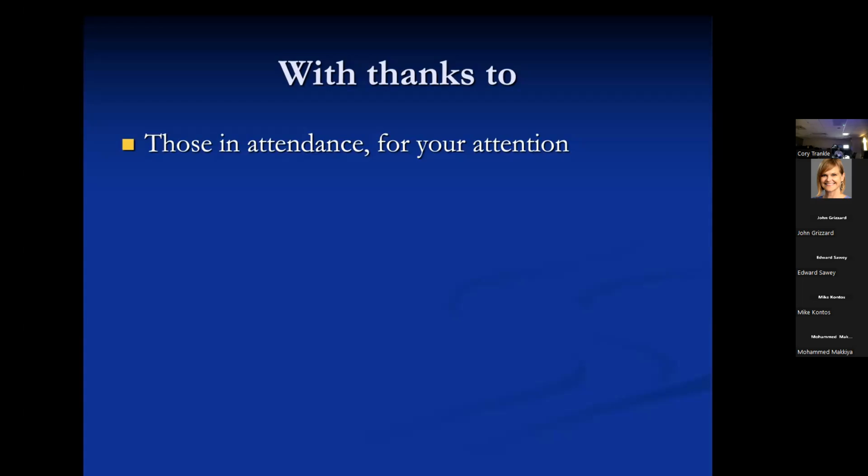Sorry to interrupt. No, thank you very much, Dr. Grizzard. It's a great lecture. I'm just following up on Ed's question, and I think you just answered it. Any sequences that you recommend in evaluating small valvular regions or fibroelastomas, or any change in the parameters of the setting that you recommend to try to tease it out?